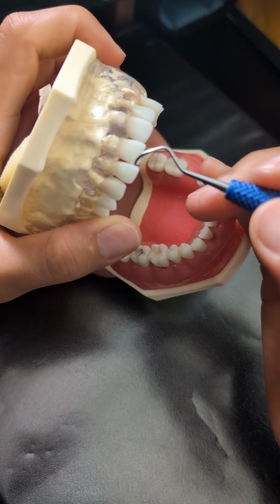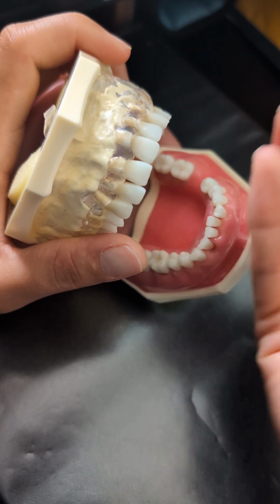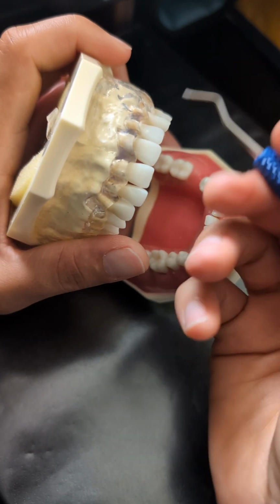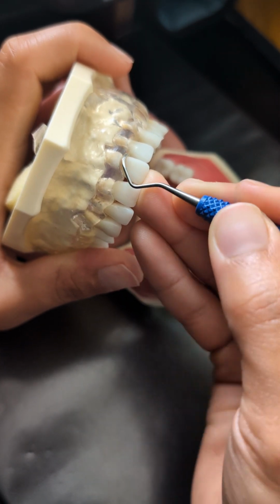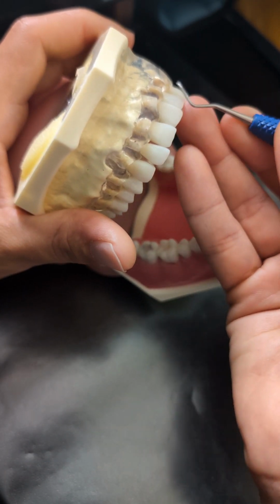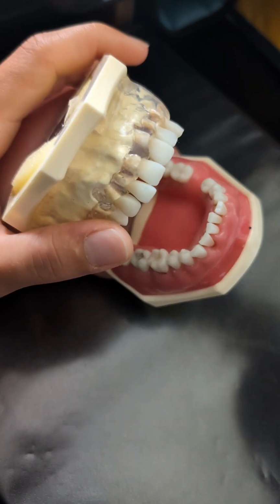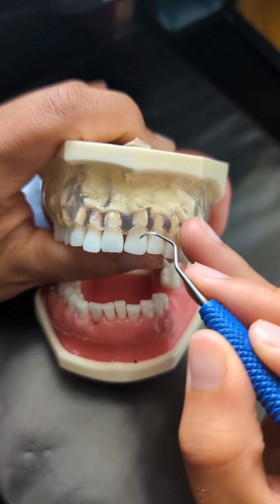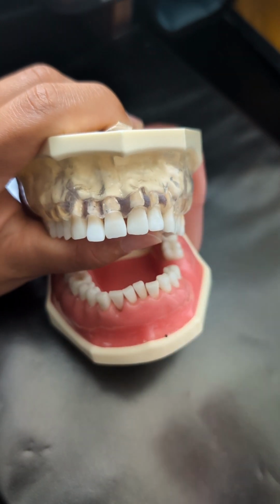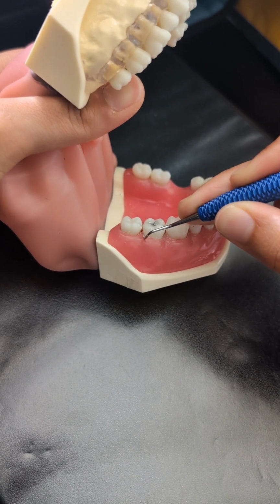To find the correct working end for the anterior teeth, we can place the instrument. If we're working toward surfaces, we can place the instrument, and we can see that this one is hugging the toward surface, and this side is hugging the away surface. We can also use Pac-Man. If we're working on the away surface, Pac-Man is eating away, and if we're working on toward surfaces, Pac-Man is eating toward. For the anterior teeth also, we are going to start from the midline of the tooth, not at the distal line angle, it's at the midline. Close, insert, open.